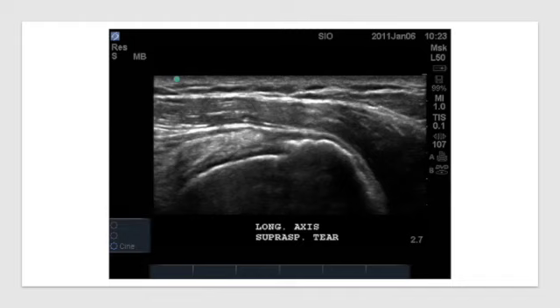This is very important to know, not only for the context of this course, but clinically, because these are something we can really have a good impact on as physical therapists. For example, my patient comes in and says, I fell down, I think I may have torn my rotator cuff. You can do an ultrasound really fast, and you can get a good sense, at least at the supraspinatus, if they potentially have a tear and need further intervention.